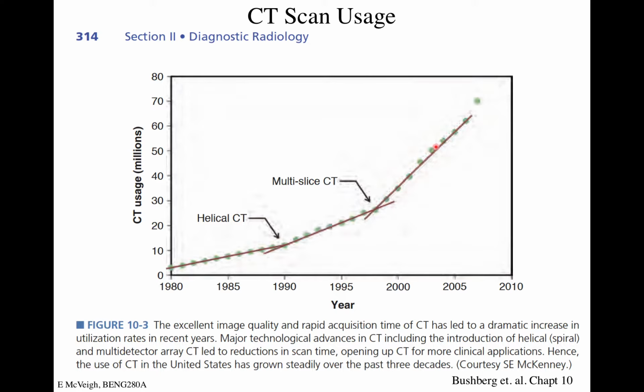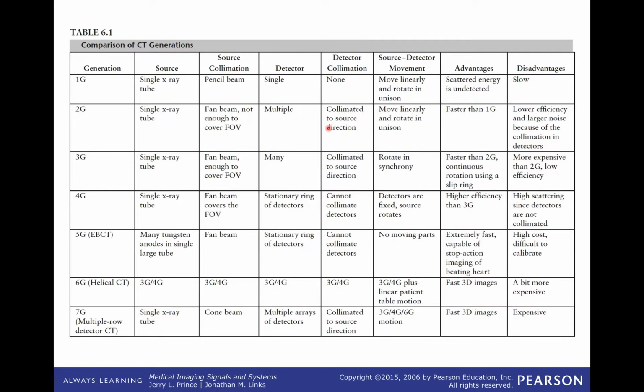To have one of these at the front of your hospital, in radiology, patients go through this thing. You just know what's going on by the time they get out of that scanner, right? Because there's no motion artifact, all this stuff. So it's a great product. And everybody followed suit. Every vendor went to these larger slices, and so the number of scans became fairly large.